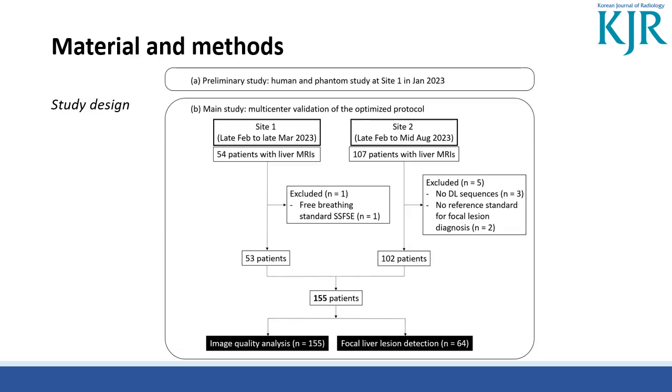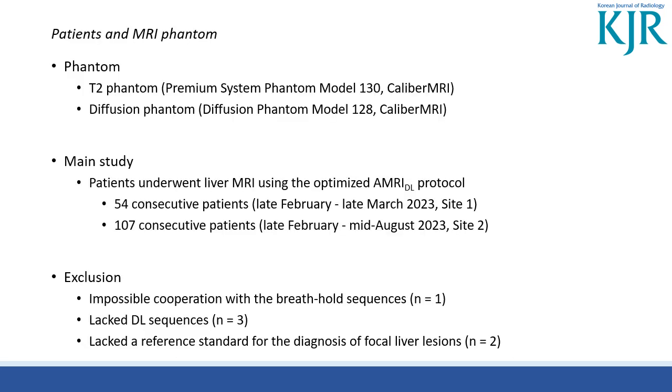Our retrospective study was structured into two phases. In a preliminary study for imaging protocol optimization, we acquired the SSFSE-DL and DWI-DL sequences from humans and an MRI phantom to generate and test various AMRI-DL sets. In the main study, the optimized deep learning accelerated sequences and AMRI protocols were validated at two study sites in terms of image quality and malignant lesion detection. We used T2 and diffusion phantom.